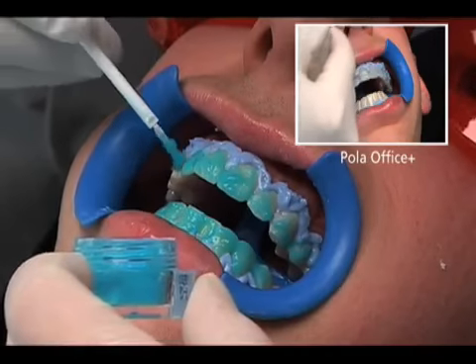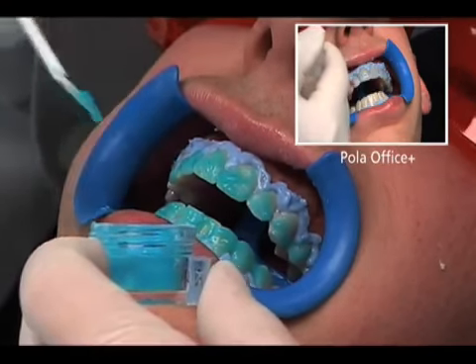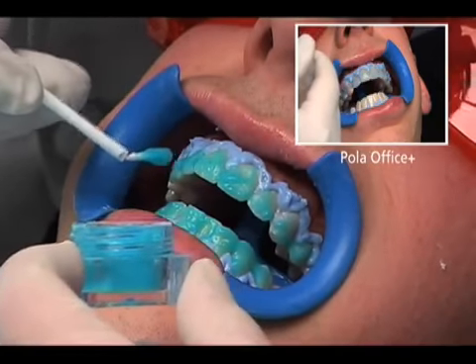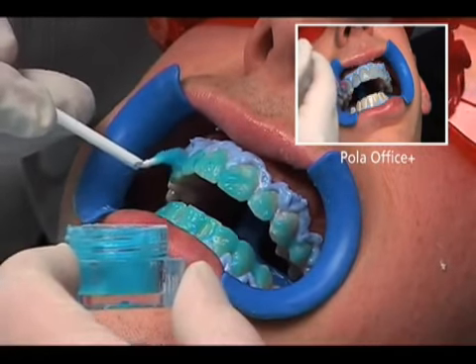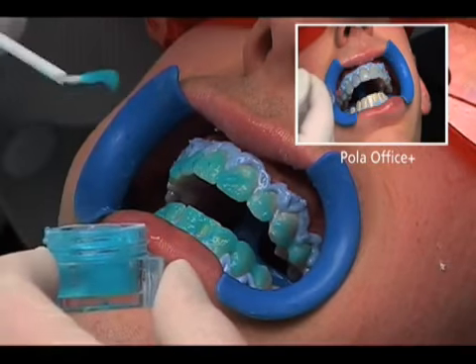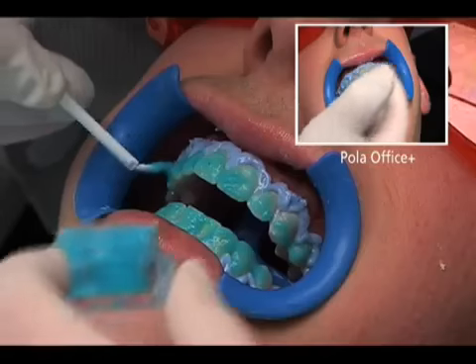If the desired tooth shade is not achieved after one application, Pola Office may be applied up to 4 times in one session. You may use the same pot for the first and second applications. A second pot of freshly mixed gel is required to complete the third and fourth applications.